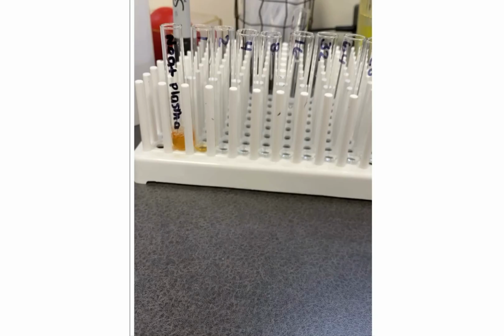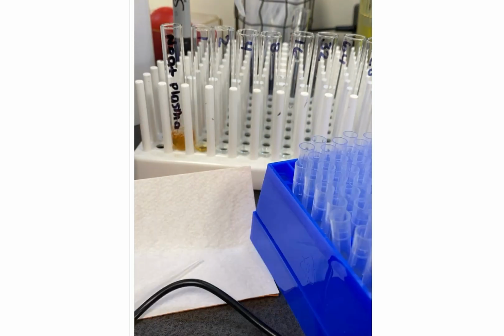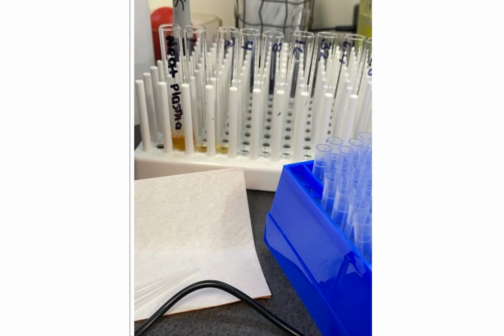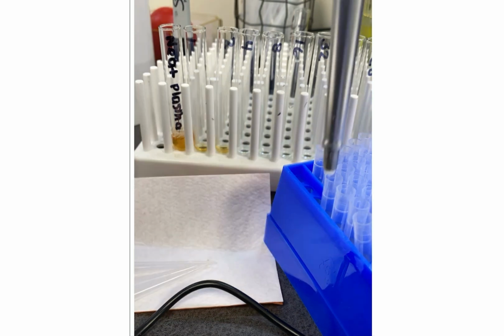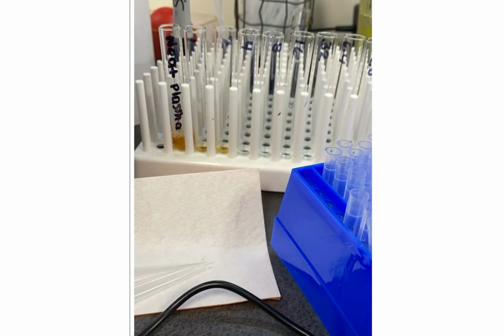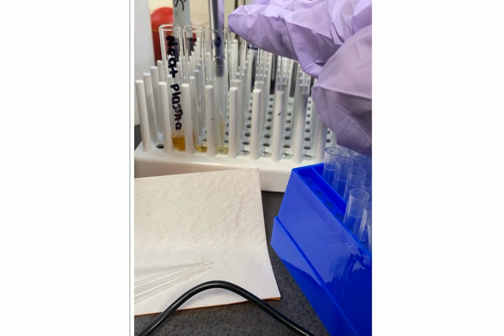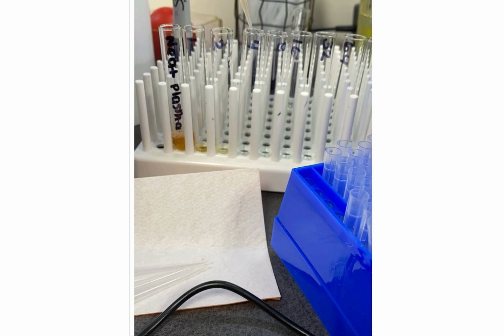To tube number 2, I'll add 100 microliters of patient plasma. This tube contains 100 microliters of saline and 100 microliters of patient plasma. This is a 1-to-2 dilution. Next, I'll take a new pipette tip, a very important step, and I'll mix the sample several times. I'll then add the 1:2 dilution to tube number 4.